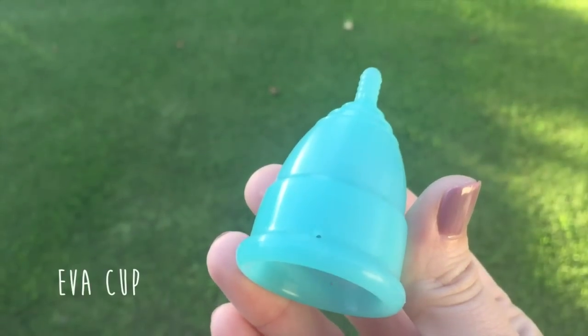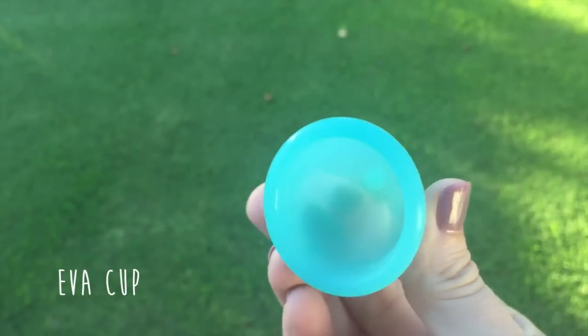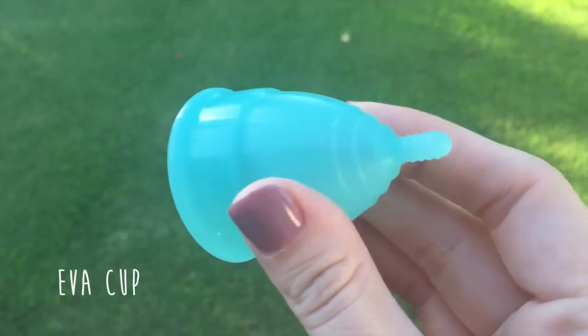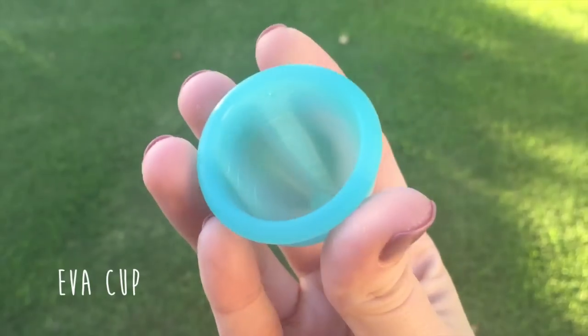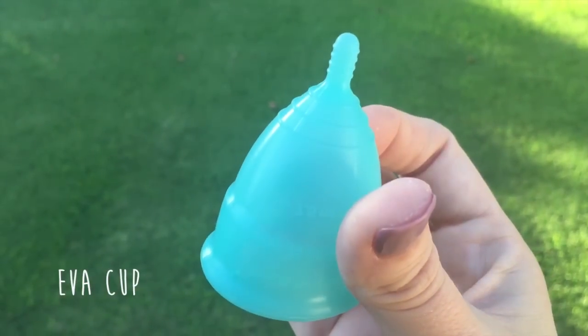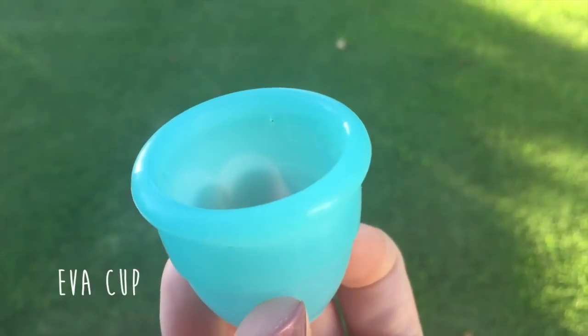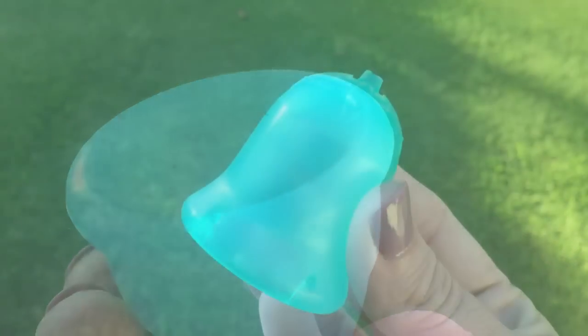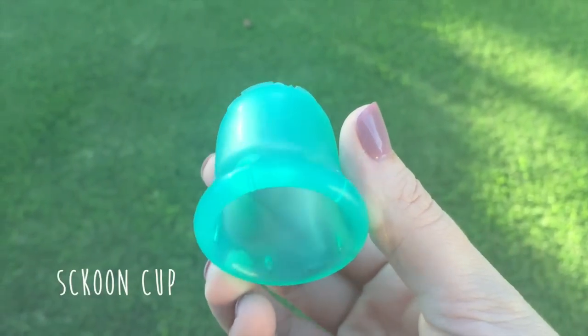Next we have the Eva Cup size 1, made in the USA, also made from medical grade silicone. I have it in the color blizzard blue. It has a diameter of 42 millimeters, a length of 50 millimeters, and a capacity of 25 milliliters.